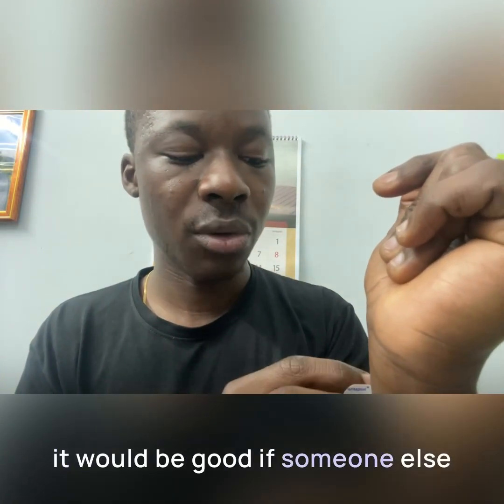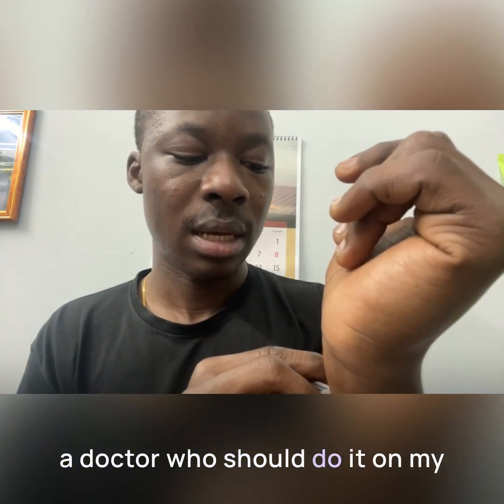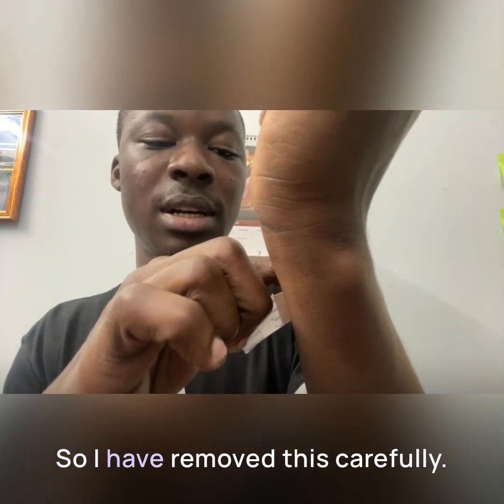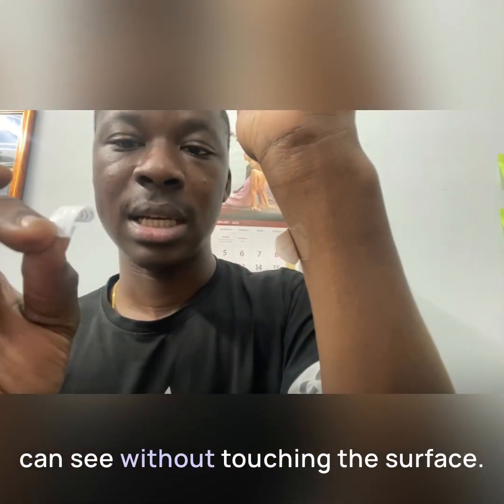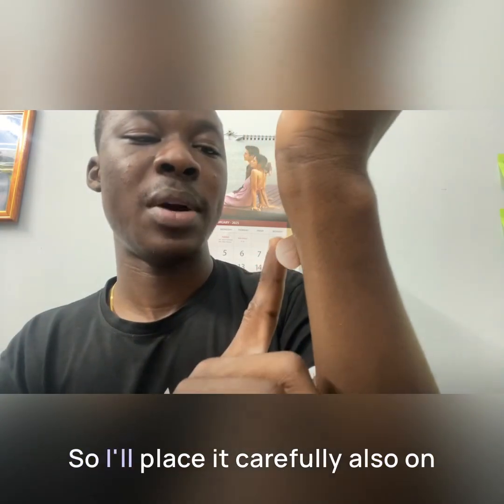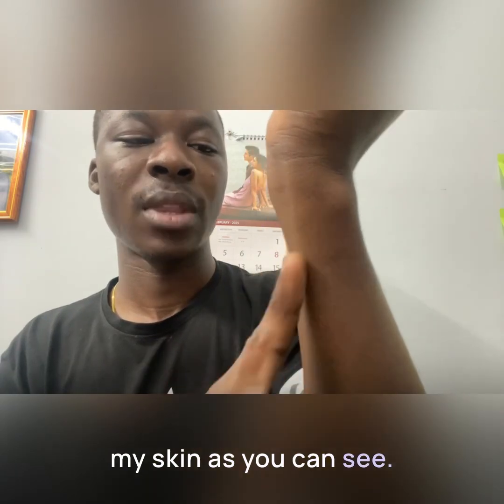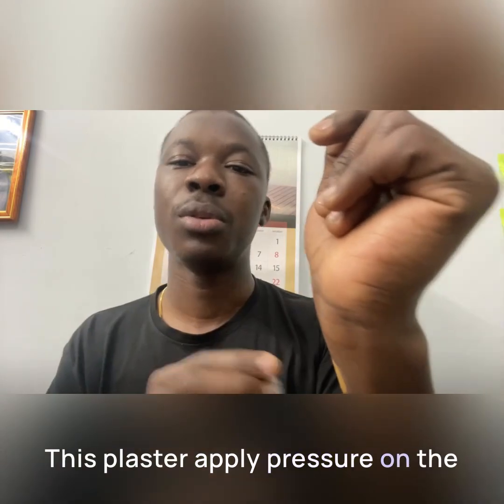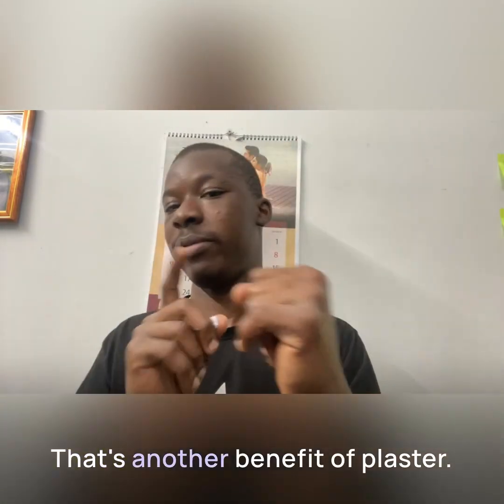It would be good if someone else was doing it for me, because it's actually a doctor that should do it on my behalf, but I'm doing this to explain to you how to use it. I have removed this carefully, as you can see, without touching the surface. I will place it carefully on my skin and apply a little bit of pressure. That's another thing: this plaster applies pressure on the wound surface and reduces bleeding. That's another benefit of plaster.